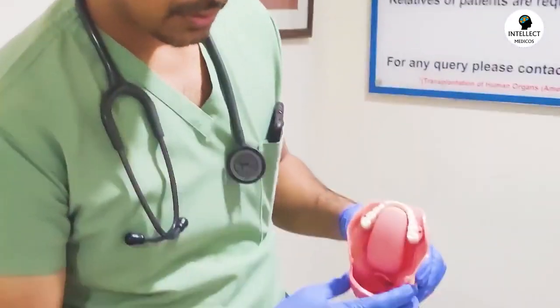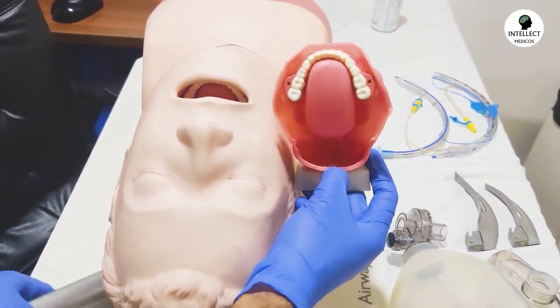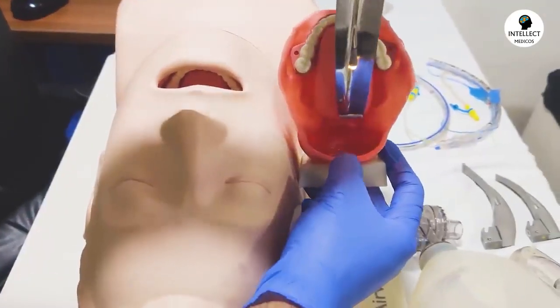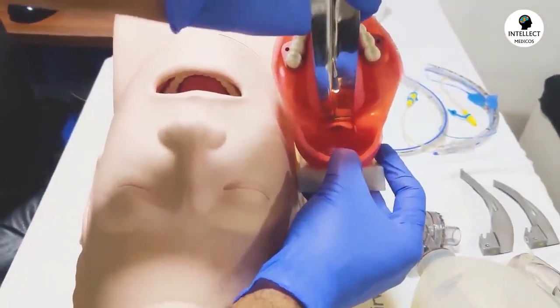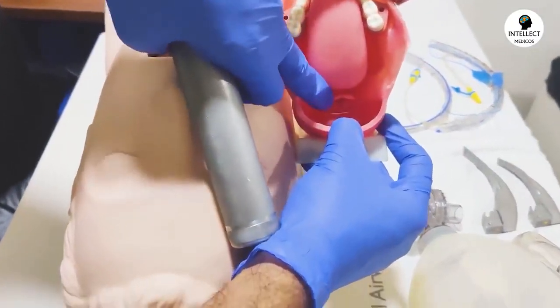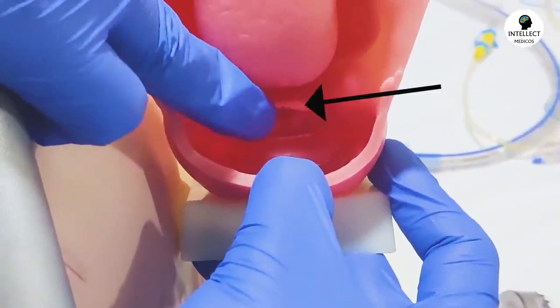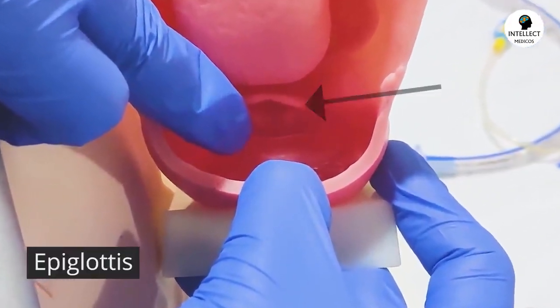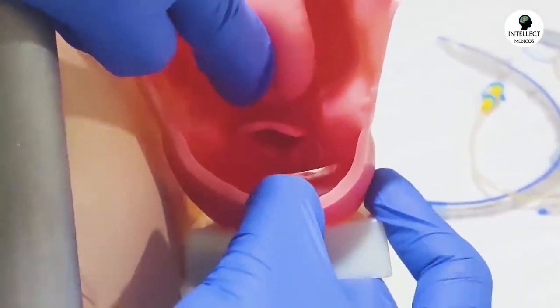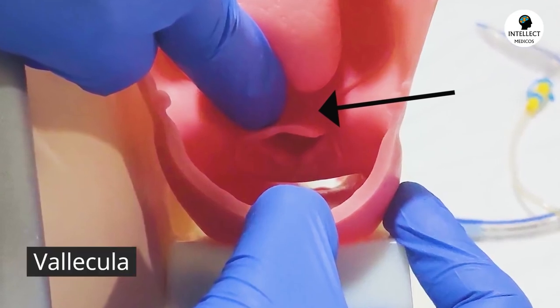Now I'll demonstrate this on this. This is the tongue. I will go like this. I will first of all deviate the tongue, and then when you see this epiglottis, can you see? This structure is called the epiglottis, and the space between the tongue and the epiglottis, this point, is called the vallecula.